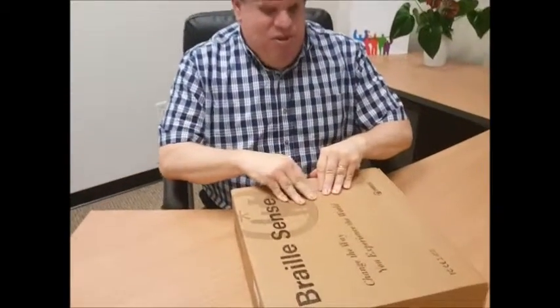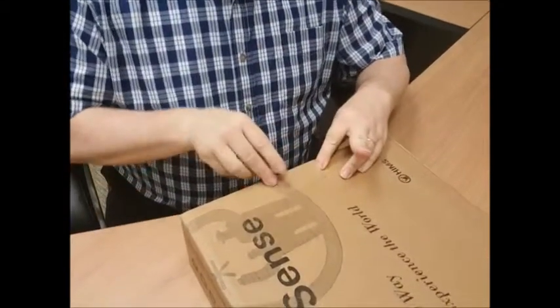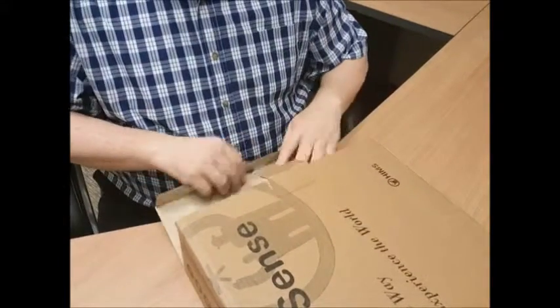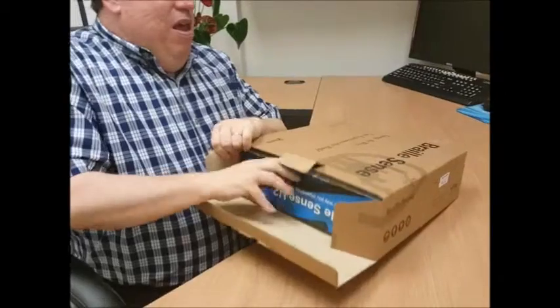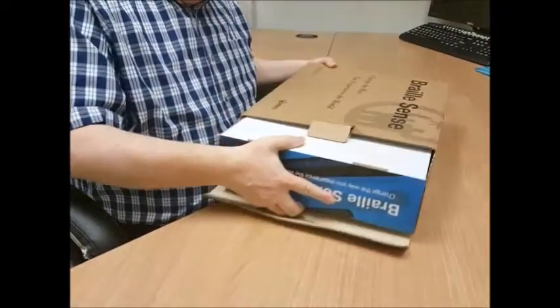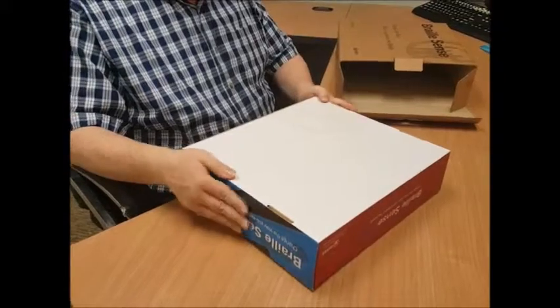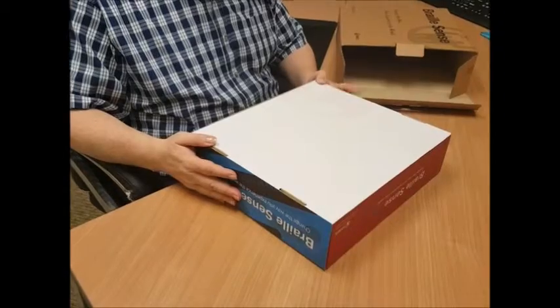We're first going to turn it towards me and undo this flap on the top. It has a locking flap to help keep the lid closed so that the inside part can't come out. Open the flap and then turn it back the other way. As I feel it here I can notice that I have it upside down, but that's alright because it's in what some people call a gift box — a glossy feeling, nice box that has compartments, which we'll show you in just a moment.